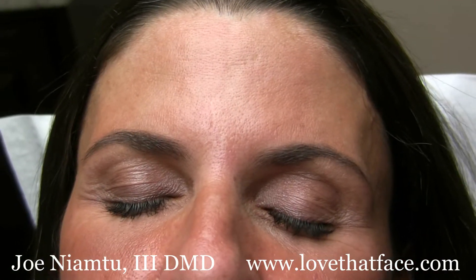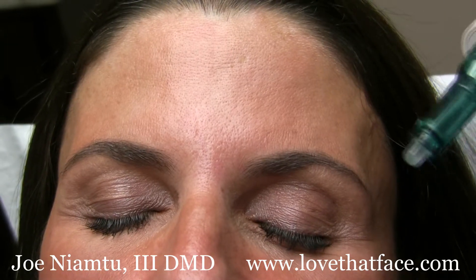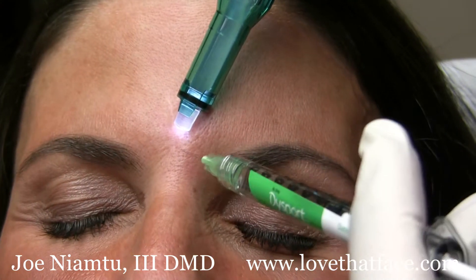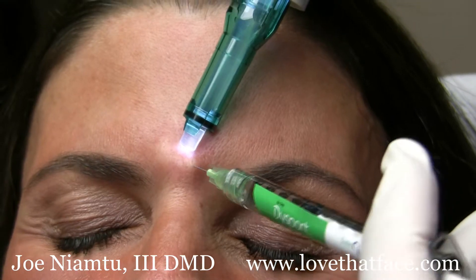I like to tell patients that it just confuses the body's ability to interpret pain. Although there are different heads for this, I like to use just this head right here. For our injections, it's kind of nice because it's small.